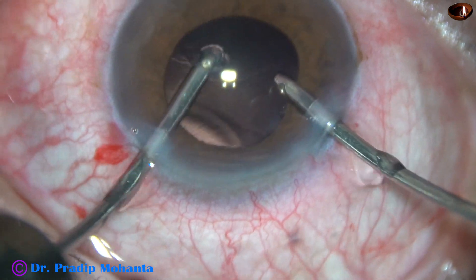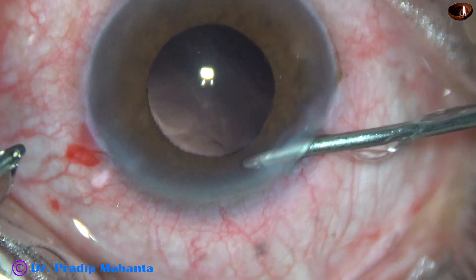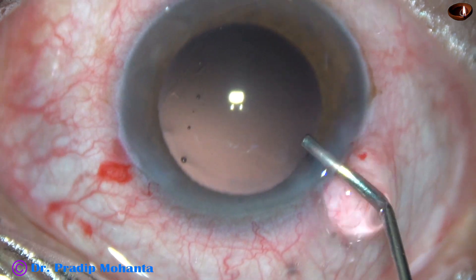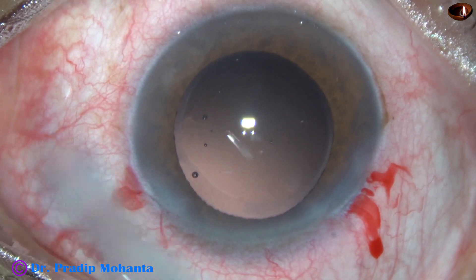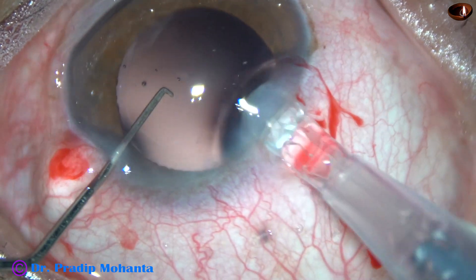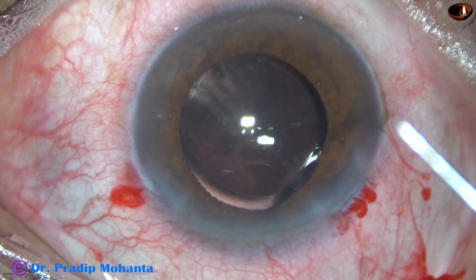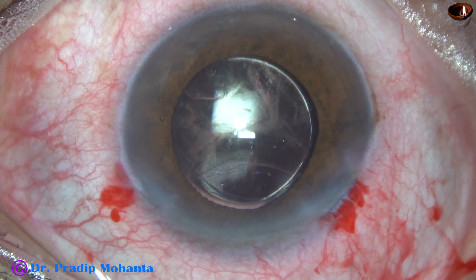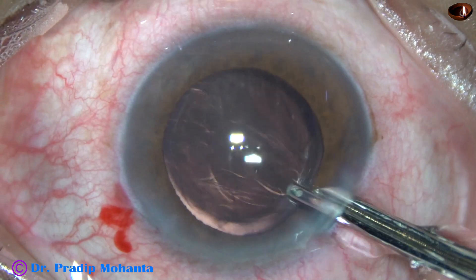If I lift the anterior lip of the main wound during this time, the anterior chamber remains well-formed. The pupil has become small — about 4 mm. As I inject VISCO, the pupil dilates and becomes about 6 mm. Here goes the intraocular lens — a monofocal, single-piece intraocular lens — injector-assisted delivery using a C cartridge of Alcon. The intraocular lens has gone into the capsular bag. Now I have to remove the VISCO filling the anterior chamber.